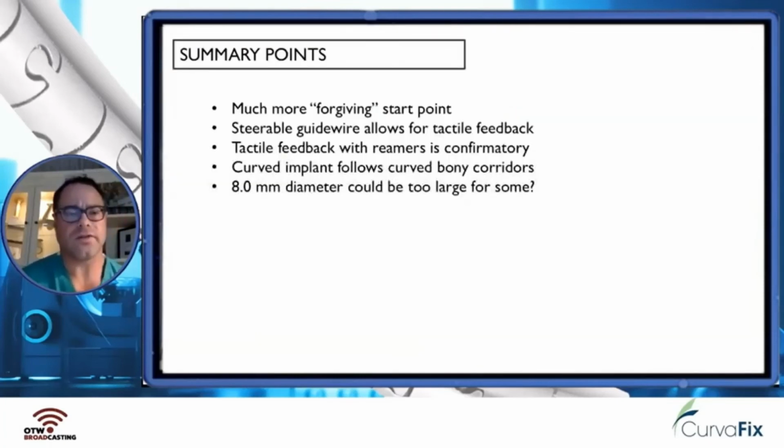Some summary points for this case and my experience overall. This was the first case I actually did with this implant, and some things jumped out to me pretty quickly. It is a much more forgiving start point. I think we sort of discussed that during the case presentation. In fact, I think potentially a more eccentric or not perfect start point might end up being a very good thing with this particular type of implant.